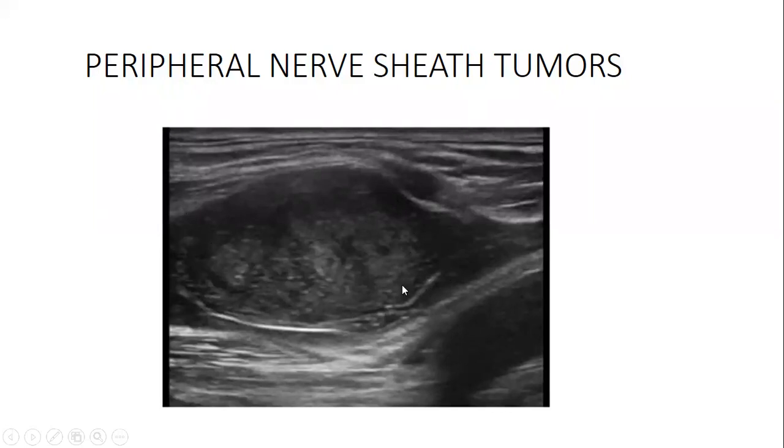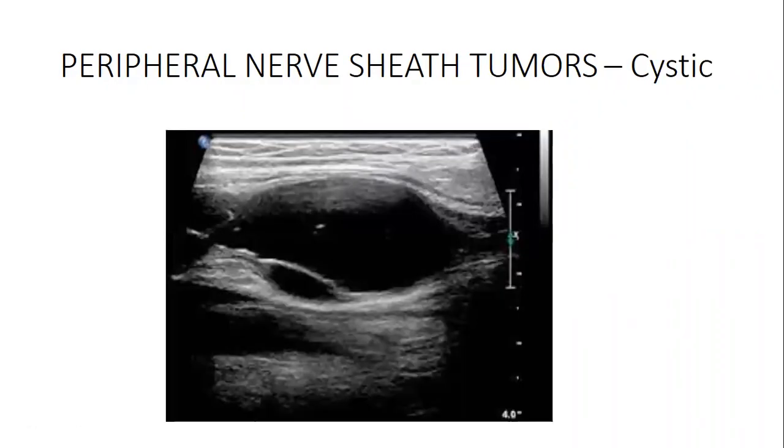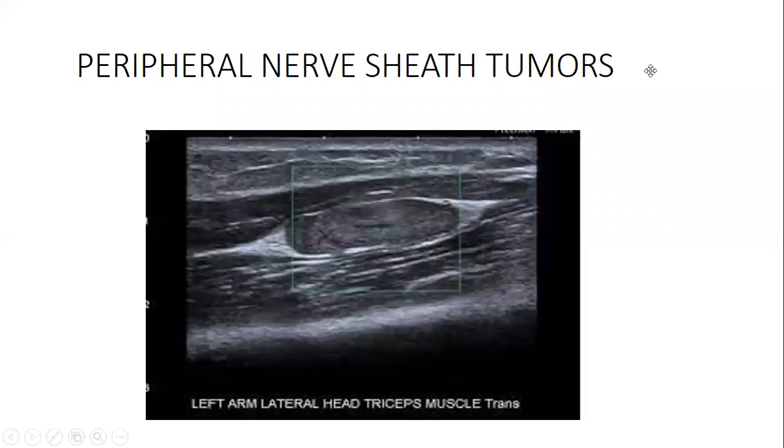So you may have a lesion like this within the elbow joint. Don't underrate it and don't over-diagnose it. Apply your color, measure it, recommend a biopsy, wait for histology, and then you conclude. Very important. You can have things like a peripheral nerve sheath tumor, which may present as a cyst. You can see this looks cystic, and you may not know whether it is malignant or benign. What are you supposed to do? You can biopsy this and then guide clinicians so that they know exactly what is going on.